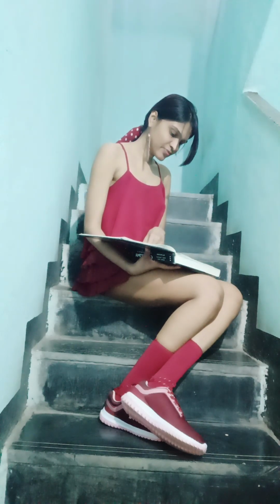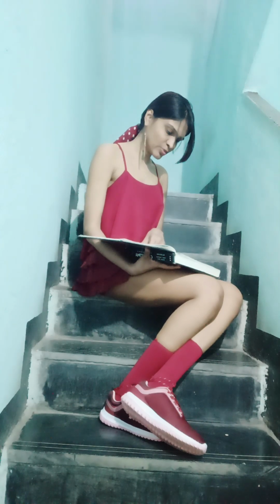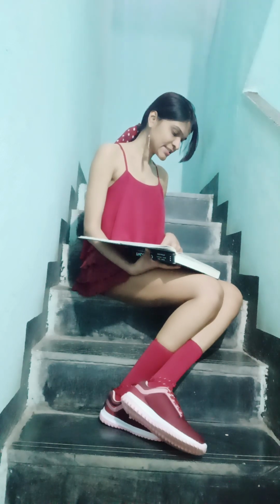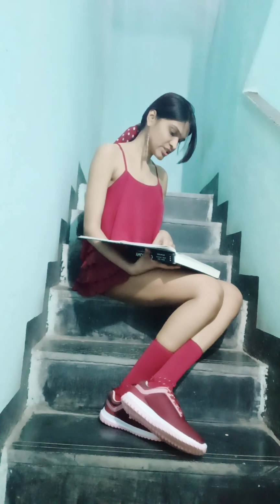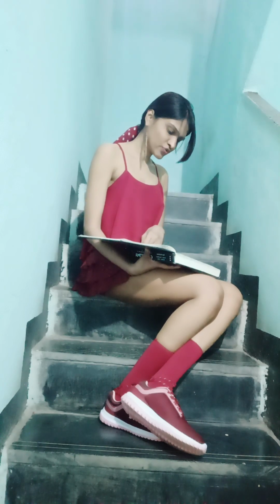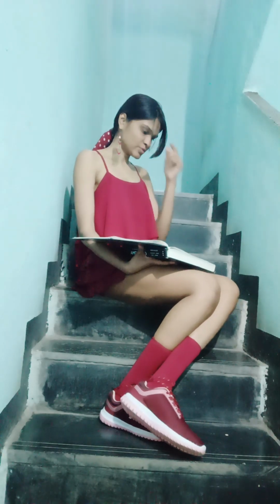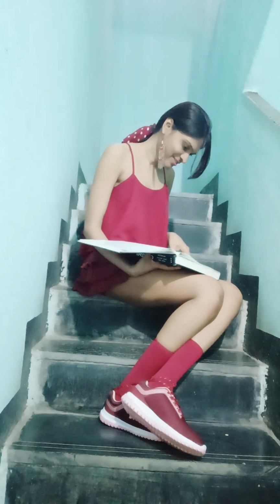Now figure C. Whereas the ciliary body band may appear dark brown in some eyes, for example A above, it may be a slate grey band in others, as seen in this image just above the iris root. Also note the numerous iris processes, which typically extend across the ciliary body band and scleral spur to the trabecular meshwork, which is medium brown in this image. D. Sometimes helpful in identifying the location of a lightly pigmented trabecular meshwork is a blood reflux in the Schlemm's canal. They have shown blood reflux in the Schlemm's canal in figure D. You can see the red line.